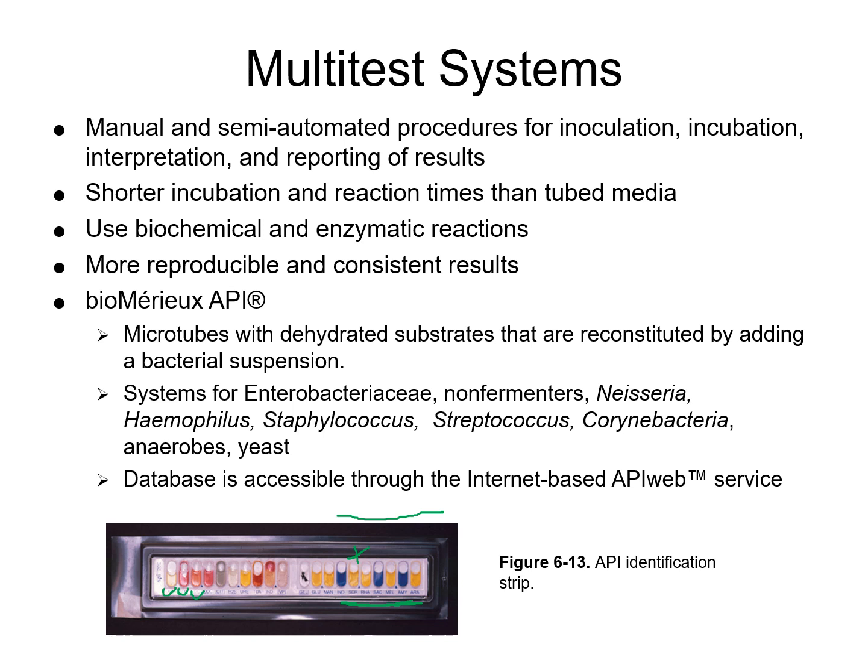These test systems come in a variety of types as far as what they can detect. This one at the bottom looks like it's probably for the Enterobacteriaceae, and there are other kits that look for your staph and your strep. Basically, all of these different tests that we've discussed are placed within the strip, and then you do those tests.